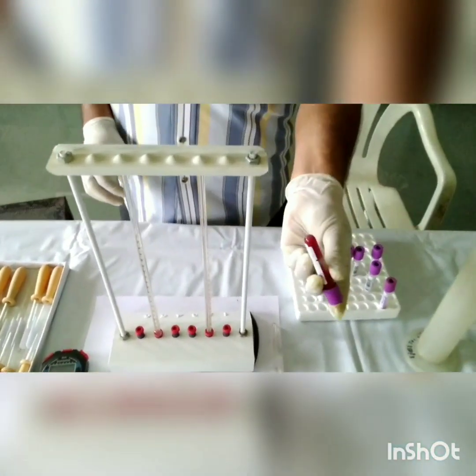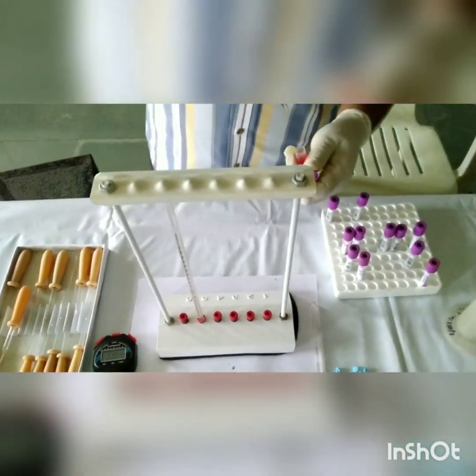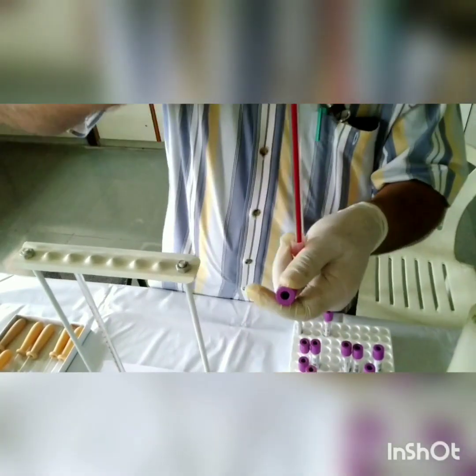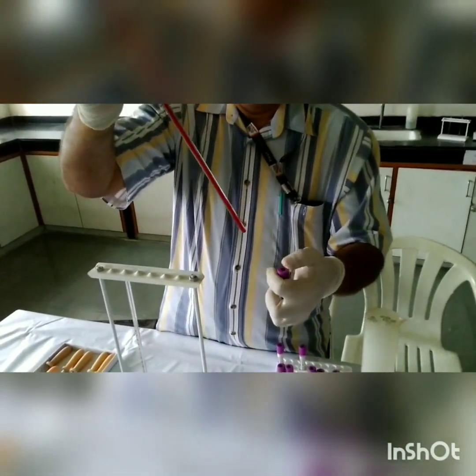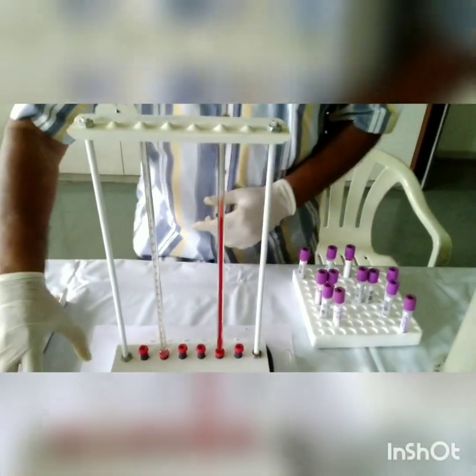Procedure for ESR by the Westergren method: under all aseptic precautions, by venipuncture, take 2 ml of blood and transfer it into a bulb containing 0.5 ml of 3.8% sodium citrate and mix well. Fill the Westergren tube by sucking up to the 0 mark at the top. While sucking through the Westergren tube, to control the blood flow, partially close the tube with the index finger.